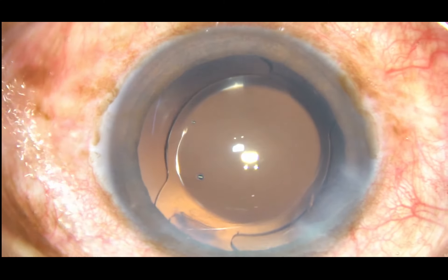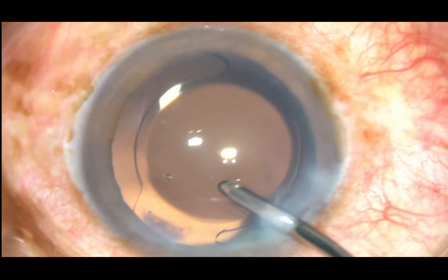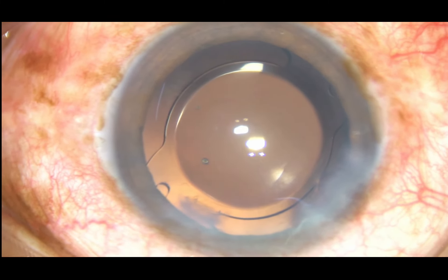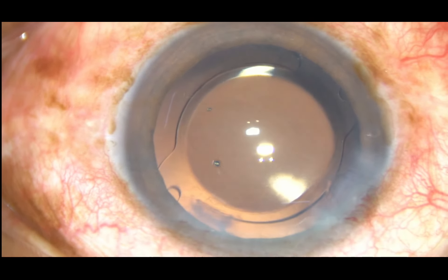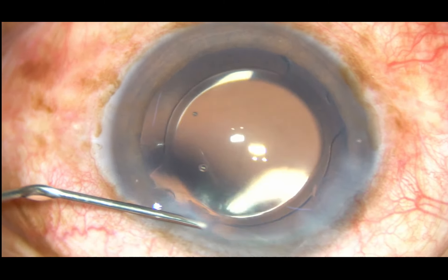In this case the lens has been implanted under irrigating fluid. You can also implant it by injecting viscoelastic substance — you just have to remove the viscoelastic substance very thoroughly afterwards. For beginner surgeons, I recommend implanting the lens under viscoelastic substance.